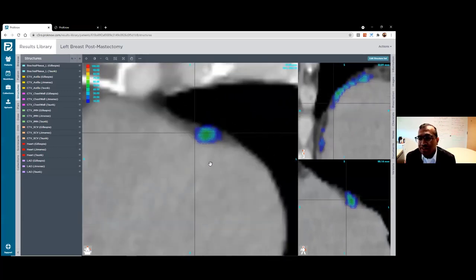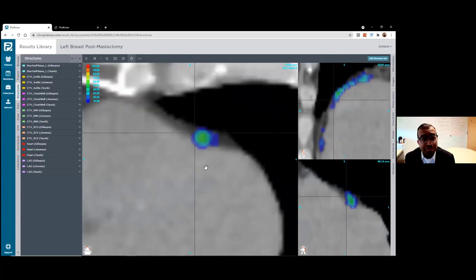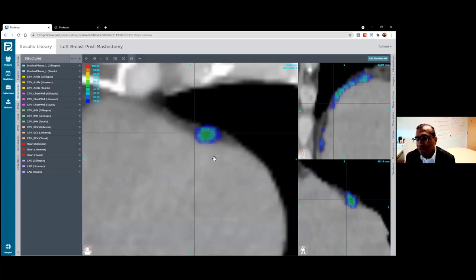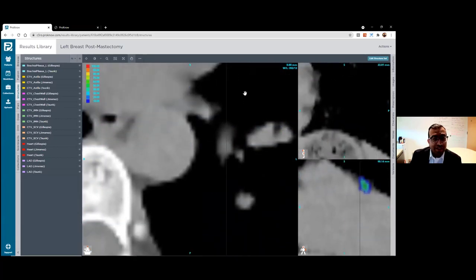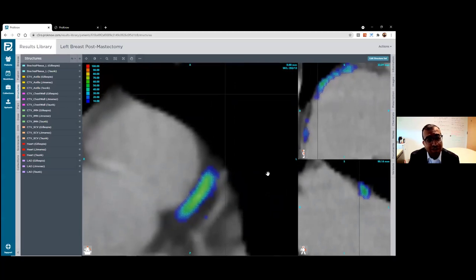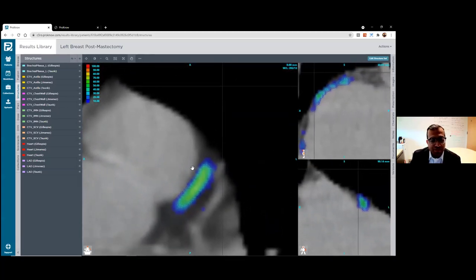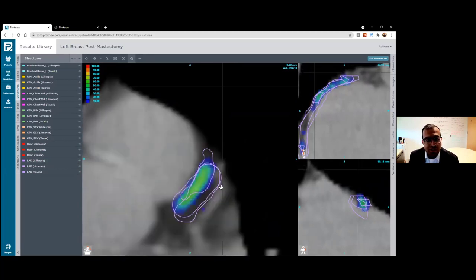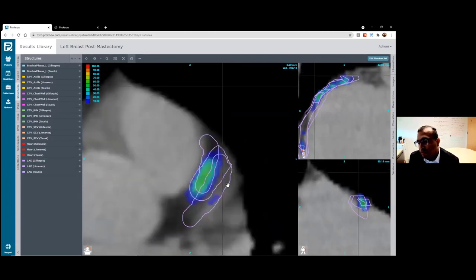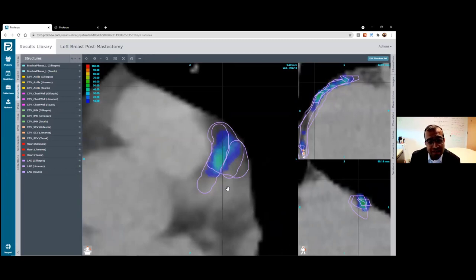What is heartening is that people are understanding that the LAD is in the interventricular groove and are mindful of that. There were some calcifications in the proximal part of the LAD that you incidentally see. At the proximal part, it looks like most people did kind of roughly start at the same origin of the LAD, went down the interventricular groove. It looks like some people contoured just the vessel versus a space. We typically contour the vessel itself. Then at the inferior end, again, vessel versus contouring the space.